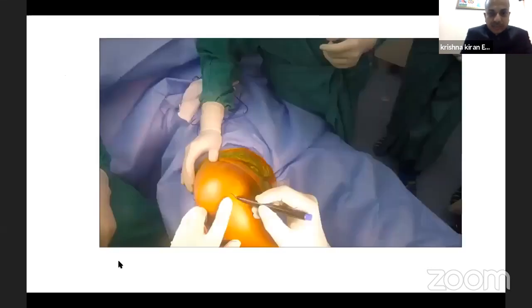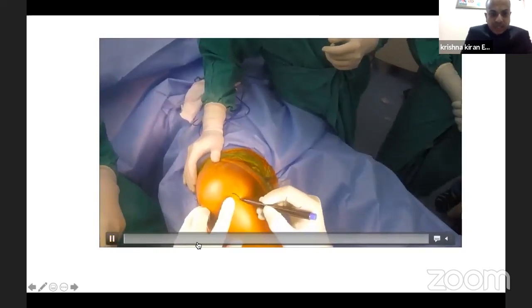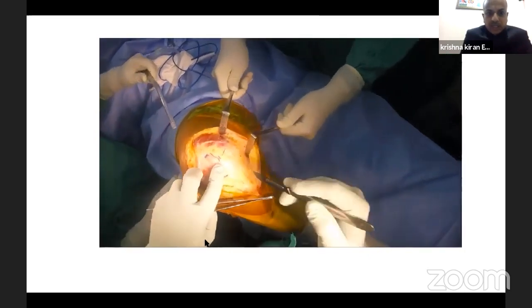So we will look at some of these steps. This is not a valgus knee or the same knee which I'm showing, but I'm just illustrating some points of the subvastus approach, which usually is like this.